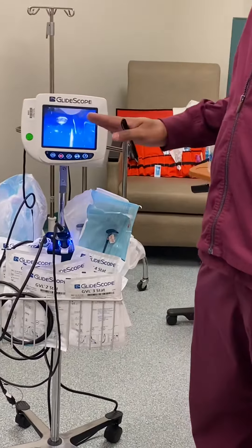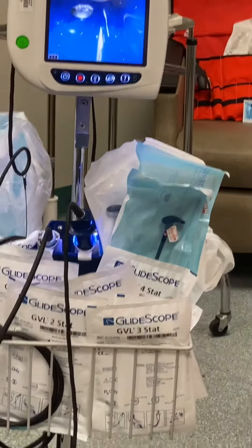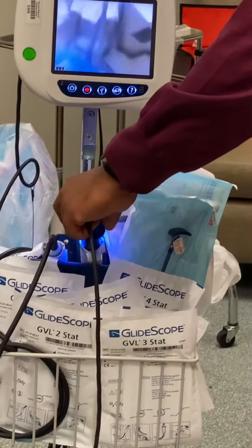You want to make sure it's plugged in all the time so that once you hit the power button it's fully charged and ready to go.